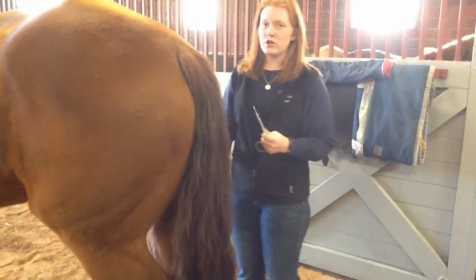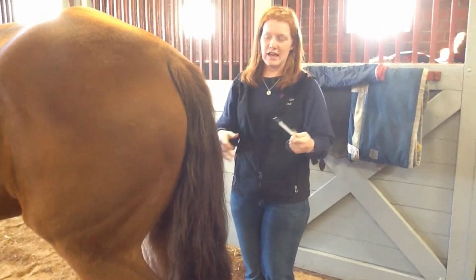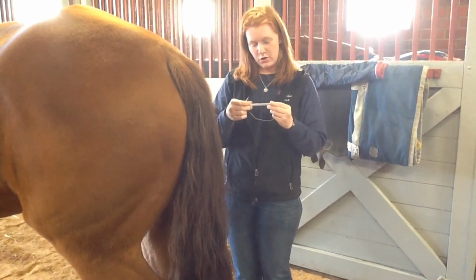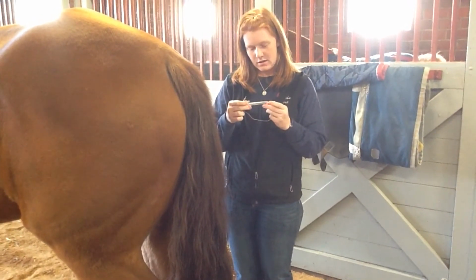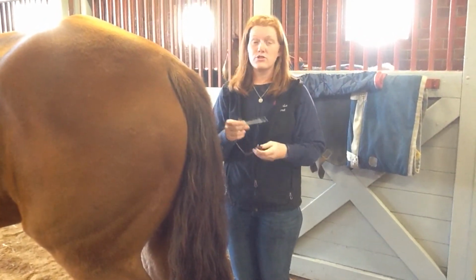Whenever you're taking a temperature, be sure to not stand right behind the horse, as that is a danger if they decide to kick out at you. You want to stand off to the side. I'm going to go ahead and read my thermometer. It is reading exactly 100, so he is within the normal range.